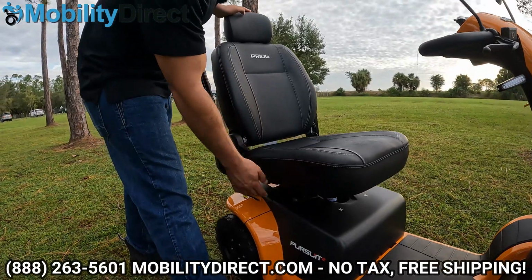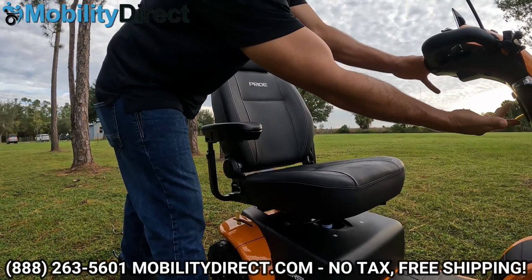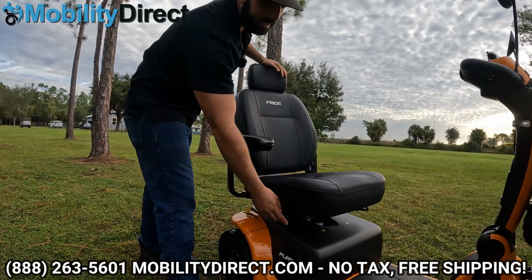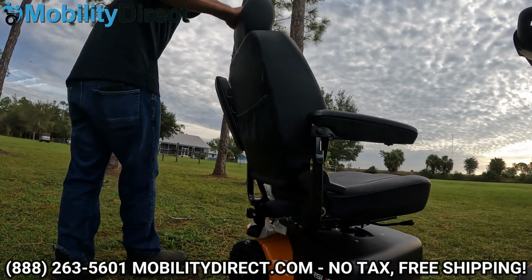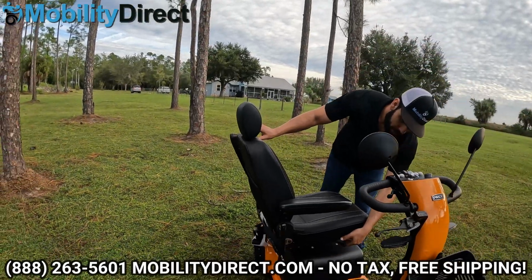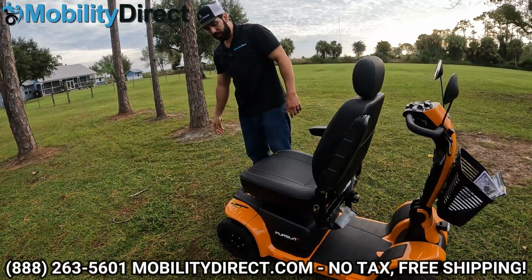You've got a rotation lever here. So when you're ready to rotate the seat, you would want to make sure that the steering column is pushed forward. We're going to use this yellow lever, push it all the way forward, and now you can actually rotate the seat by using this lever. So you can go 360 degrees. And what's nice about that is when you pull up to a dinner table, you can actually rotate the seat all the way, and now you don't have the steering assembly in front of you.